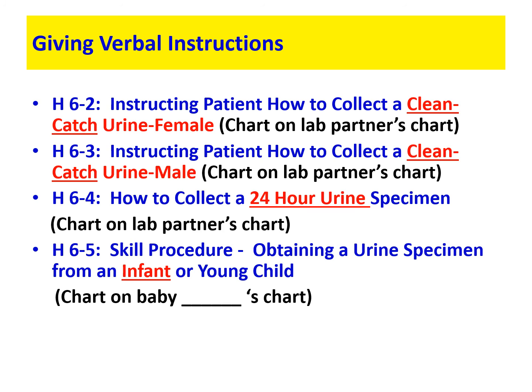Okay? You can write your baby's name on here. Baby boy Smith, baby girl Smith, and then you will have an infant chart in the back that you can then write that patient's name on that chart and chart for that patient, okay? But there is a chart for your infant in the back, and please make sure you're charting all this on all your patients. So again, we know the procedure that we go through from washing our hands to performing our introduction and ID, right? And we will check off on those and initial that we've done that and practice doing that with possibly someone in your house if you can, okay?